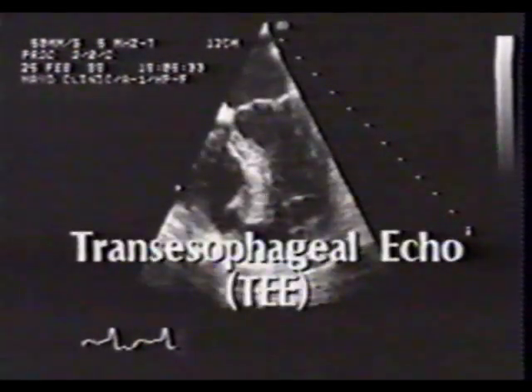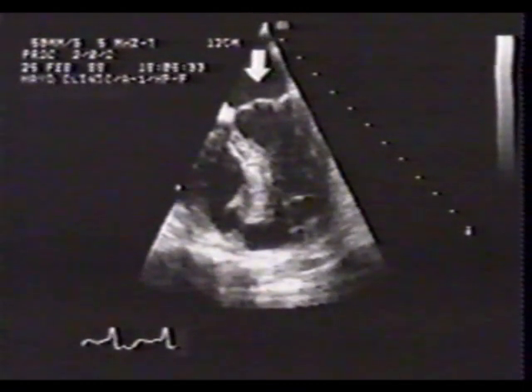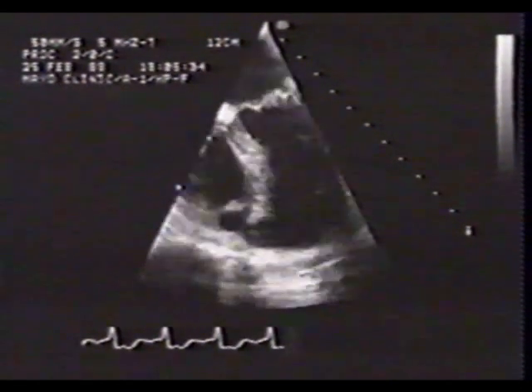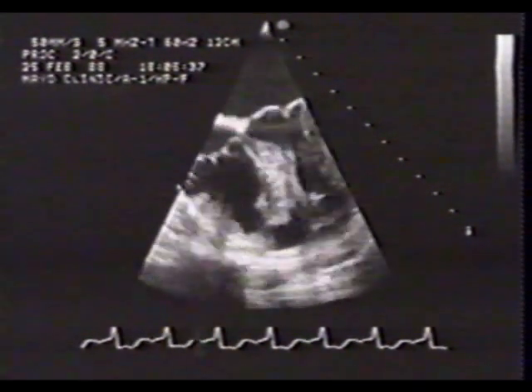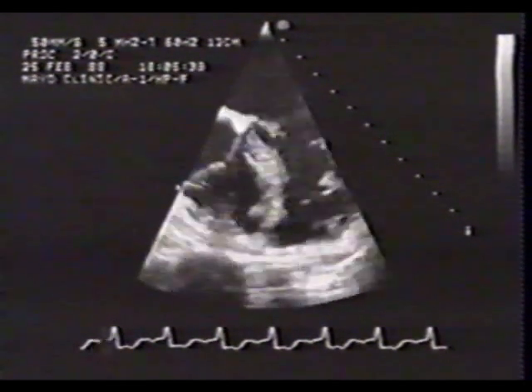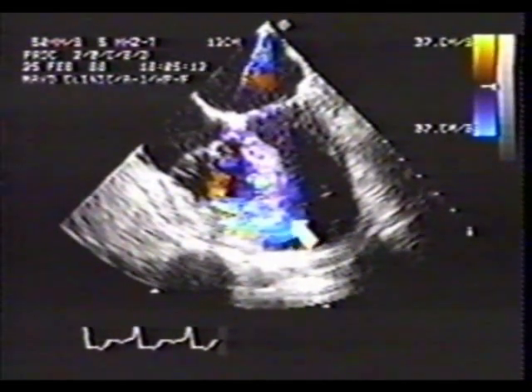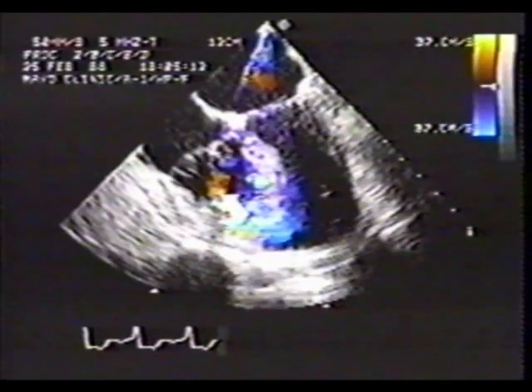The situation was fully clarified via transesophageal echocardiography. The transducer is in the esophagus, behind the left atrium. This is the left ventricle, and this is the apical septal rupture. This is a 2D example of a simple VSD, straight through the septum from left ventricle to right. Color flow imaging confirms the shunt from left ventricle to right.